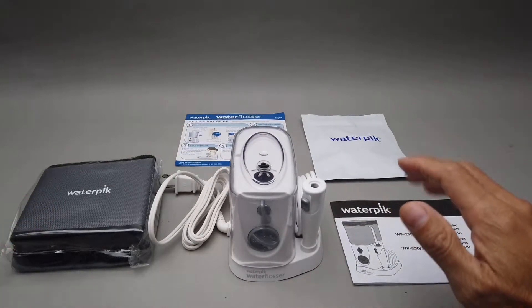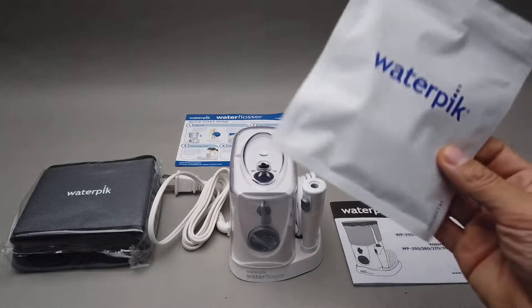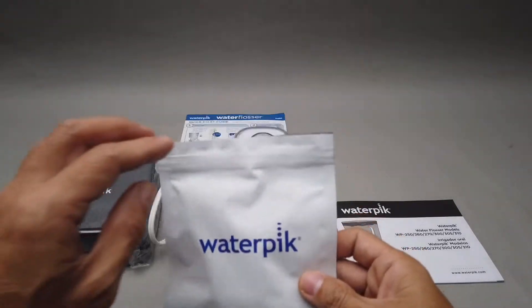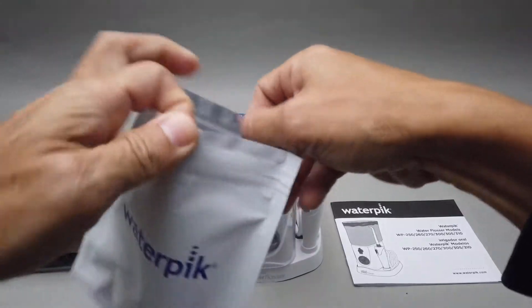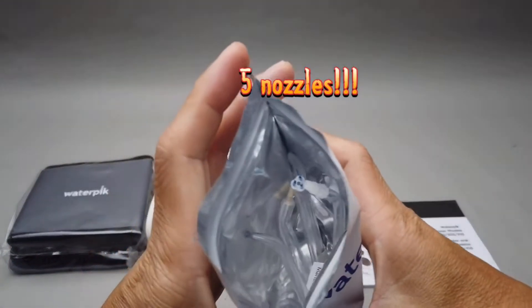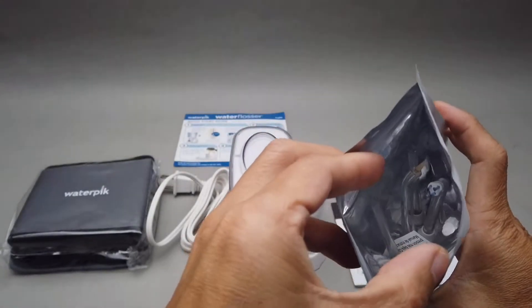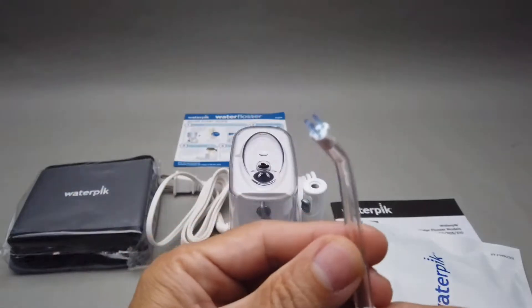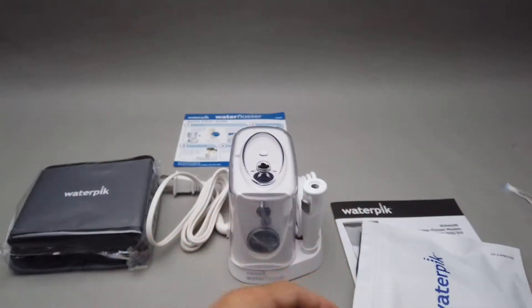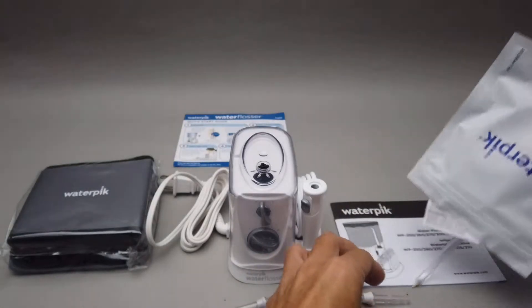My whole combo comes with just one bag of Waterpik nozzles. One bag here contains six different types of nozzles. You got one that has a brush — just one of each.